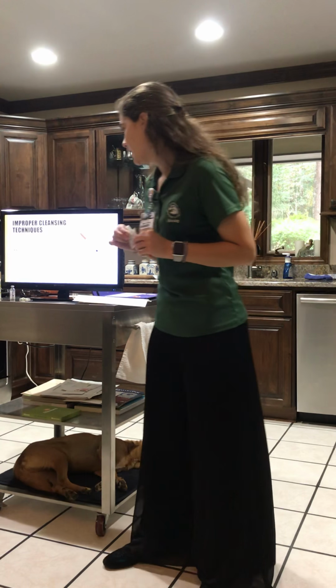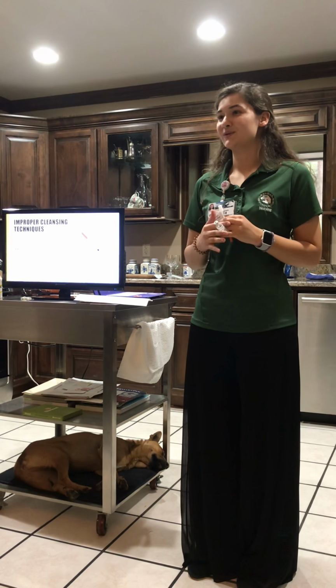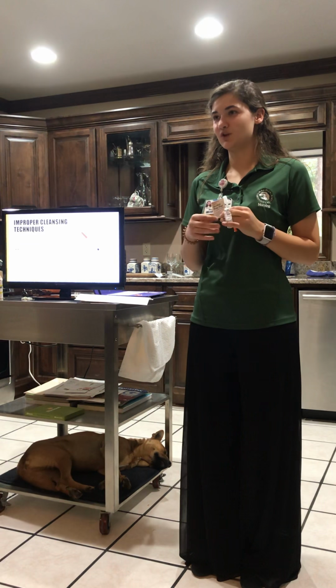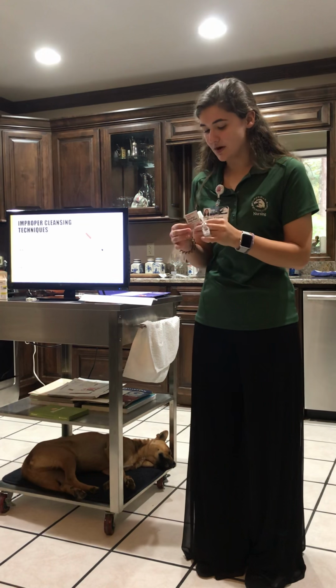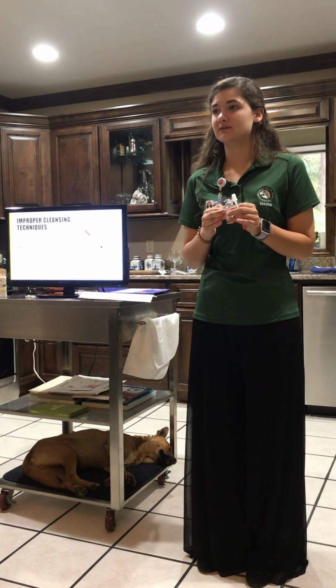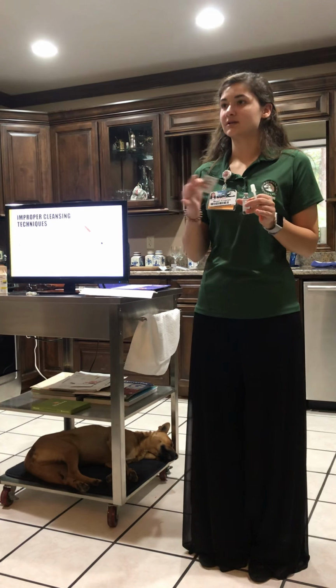And you also want to allow the skin to dry completely, so that it doesn't sting as bad wherever you inject, and that it'll be clean, but it won't sting, because that's not pleasant. And you also want to make sure that you clean the top of the insulin vial, because especially if it's not a new insulin vial and you're reusing it, contamination can occur.